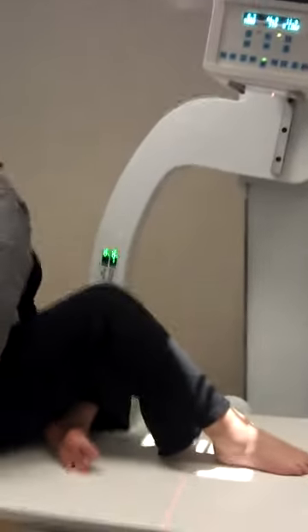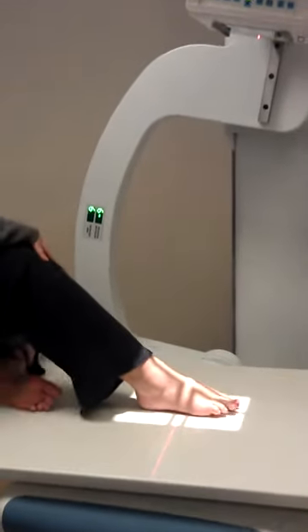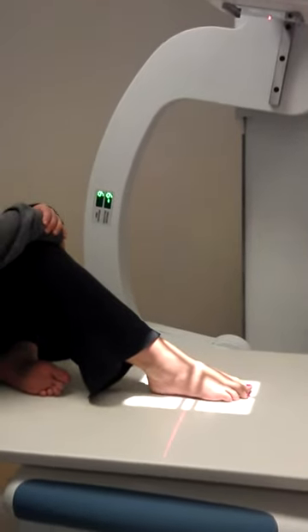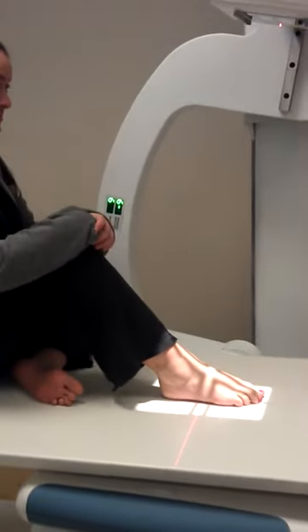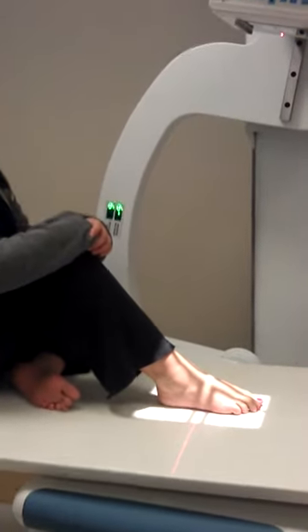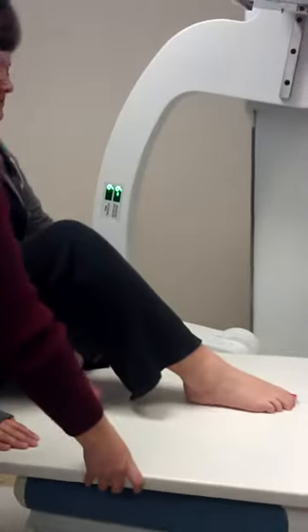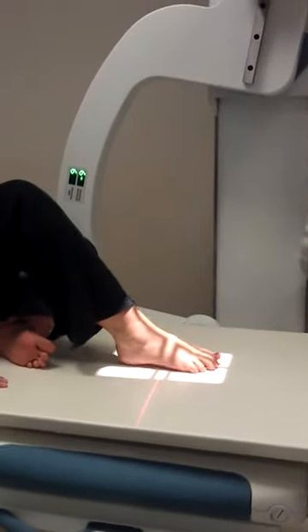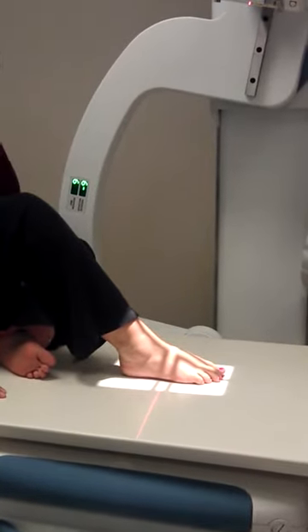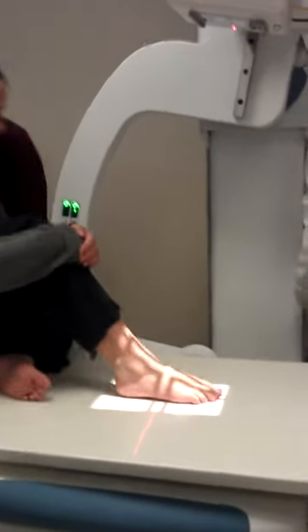Then you can position your patient. It will be easier for you to slide your patient than to move the table. If you want to move the table, you're more than welcome to move the table. When you unlock the wheels, they work independently from each other. So if you're adjusting here, that'll move, but this doesn't — it just makes it hard. So if you can, just ask the patient to slide over. Whoever created this table — chances are it was a man who wasn't a tech.